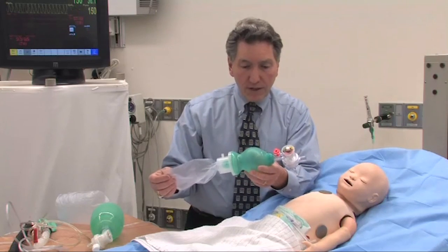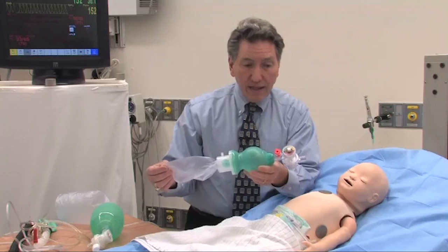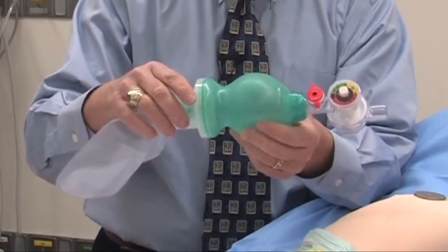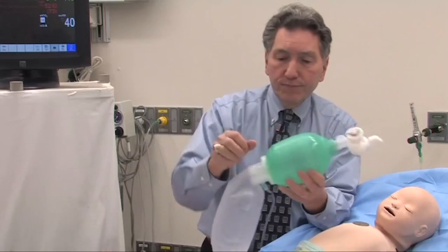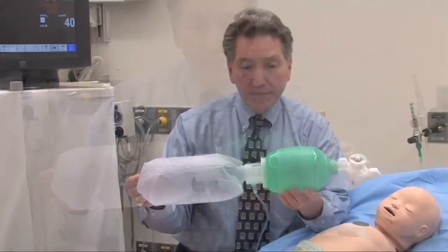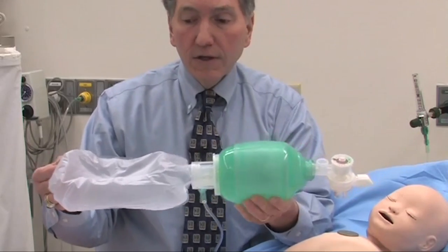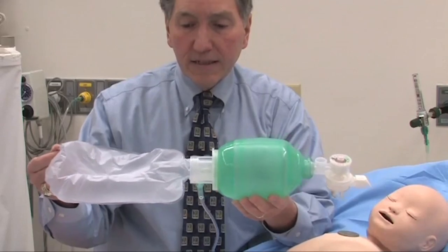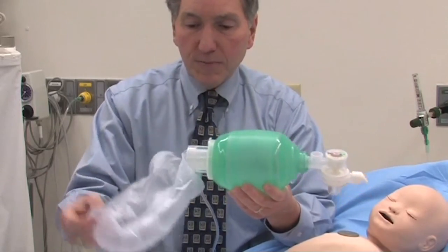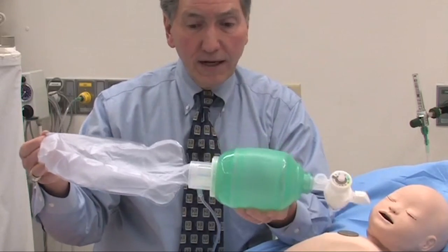If you do want to give oxygen, you can attach it right here — I've got a bag that has it already attached. There's a reservoir here very similar to the reservoir on the non-rebreather mask. If I'm ventilating the patient in a reasonable fashion so that this reservoir bag doesn't completely deflate, I can give close to 100% oxygen, because the oxygen fills up this bag and the green bag will refill from this reservoir bag. I can always turn up my oxygen flow to keep the reservoir bag full.